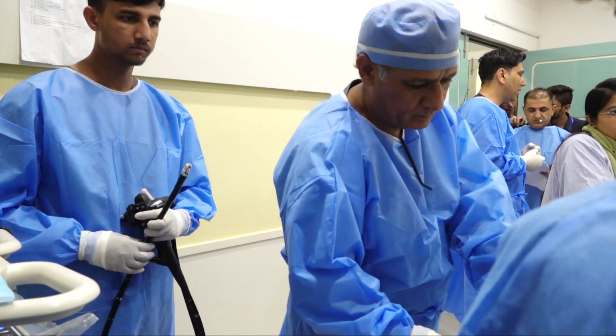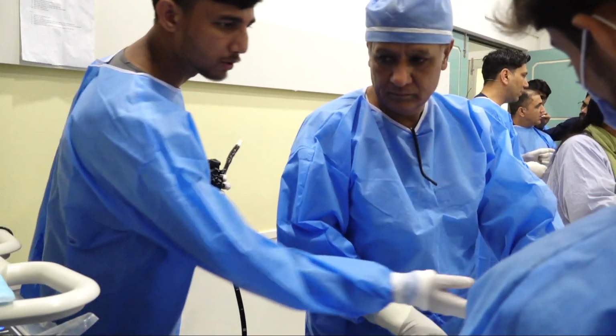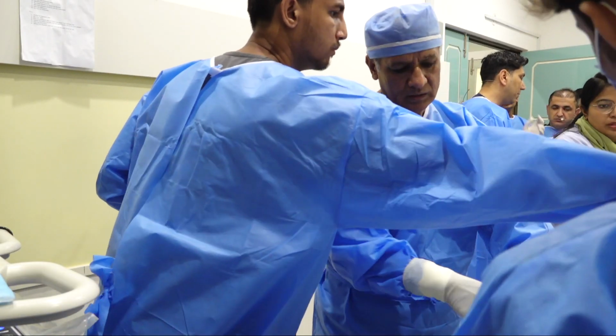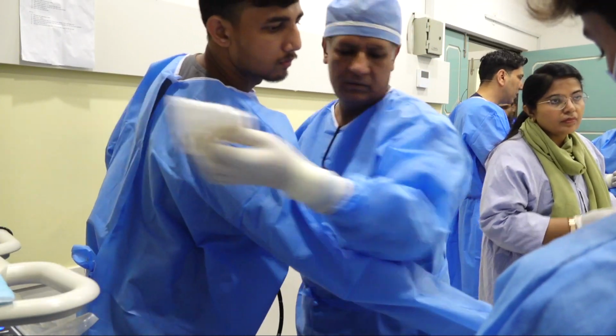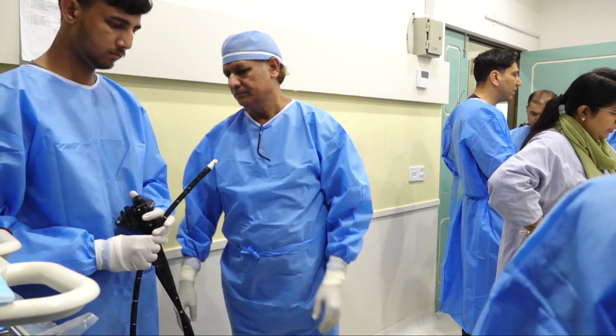There are certain areas where EUS can actually add to the staging of the disease. One of those areas is perihepatic ascites. So there's a small amount of perihepatic ascites which might have been missed on other cross-section imaging modalities. So, is perihepatic ascites present or not present, number one. Number two, are there any focal hepatic lesions in the left lobe?